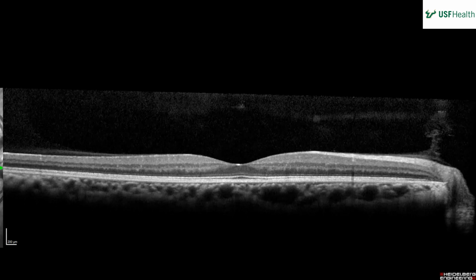Start with outer to inner. RPE, you're close. First one's RPE, the second one is what'd you say? The ellipsoid zone, then the interdigitation zone. You flipped those two. Interdigitation, then ellipsoid zone. You remember because interdigitation means the RPE is connecting to the photoreceptor, so essentially you have two RPE layers, the back of the RPE and the front of the RPE shown separately. So you've got RPE, interdigitation, ellipsoid, and then what about the light one inside of it?